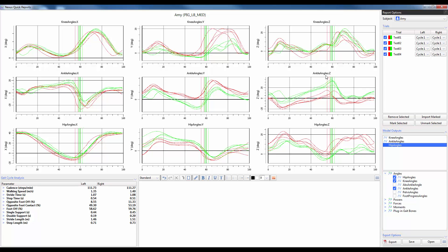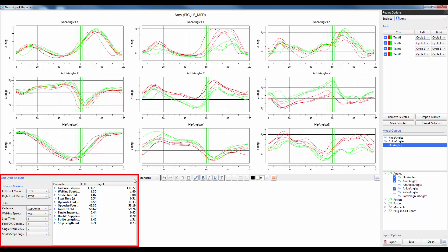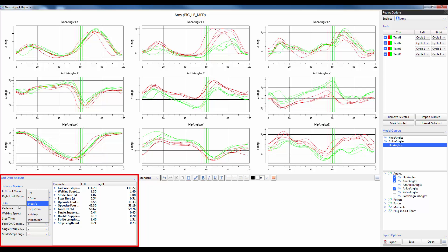To modify the units of the gait cycle parameters simply click on the arrow beside gait cycle analysis and go ahead and use the drop down boxes to change the units as well as which markers are used to calculate these gait cycle parameters.